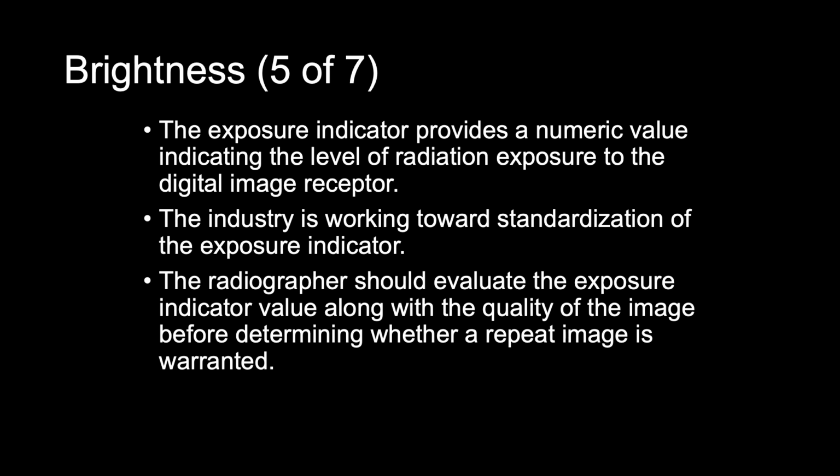So every department you work in will have different EI standards. So just depending on if they use GE or Siemens or what operating system they use to make a digital image, but they'll have different EIs that are within the normal range. So you'll need to know what range your EI is in.